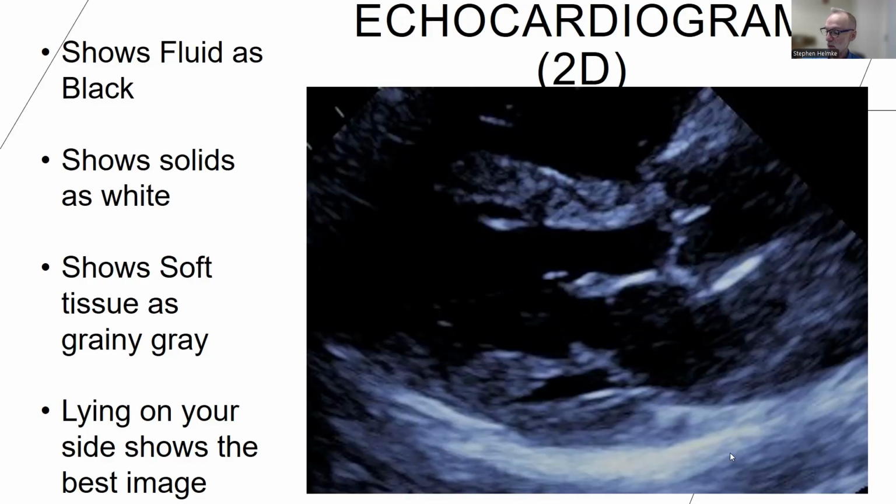On the other hand, when they hit a very solid sort of structure that's fibrous, they will bounce off that structure completely. So all of the echoes come back, and that shows as white. And in the middle are the gray parts. That's flesh or soft tissue, because some of the echoes bounce back and some of them go through. Every time an echo finds a spot that it reflects off of, it puts a dot there on the screen. And all of those dots together add up to the image that we see.